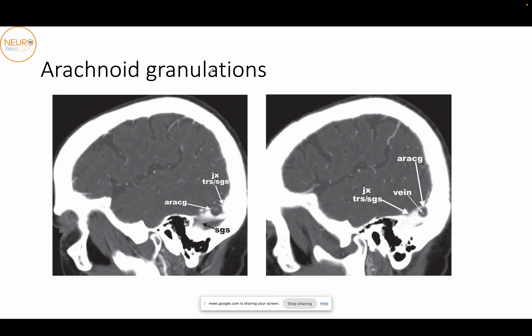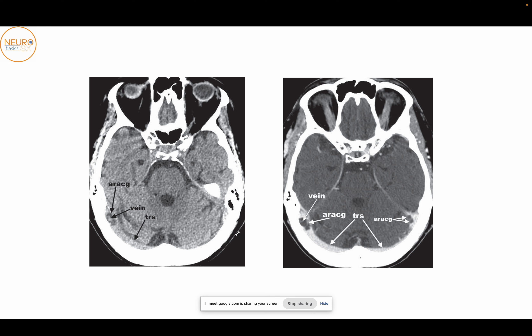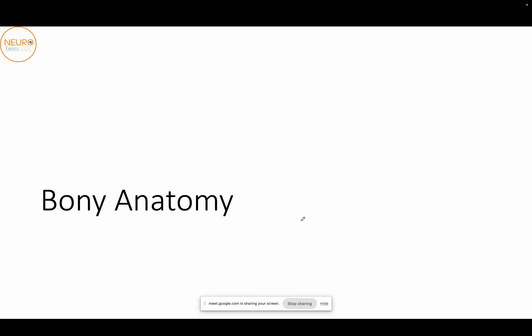An important structure you can identify on CT scans is the arachnoid granulations within the venous sinuses — they will just look like blocks or obstructions in the sinus. On a contrast scan where the sinus is filling, you can see this massive area within the transverse sinus which is not filling with contrast. Sometimes it is easy to misconstrue this as a sinus block, but actually it is just an arachnoid granulation. The way to pick this up is that within the arachnoid granulation, if you look closely, there will be a vein running through the center of it. The same thing is visible on both axial and contrast scans — you can see the transverse sinus with the hypodense area within it that is not filling, and the slightly hyperdense vein running through the center.